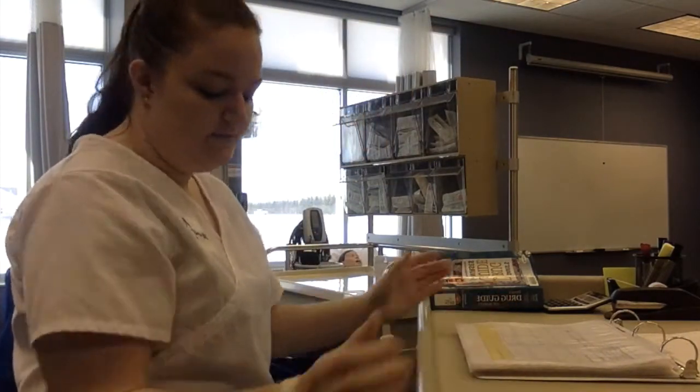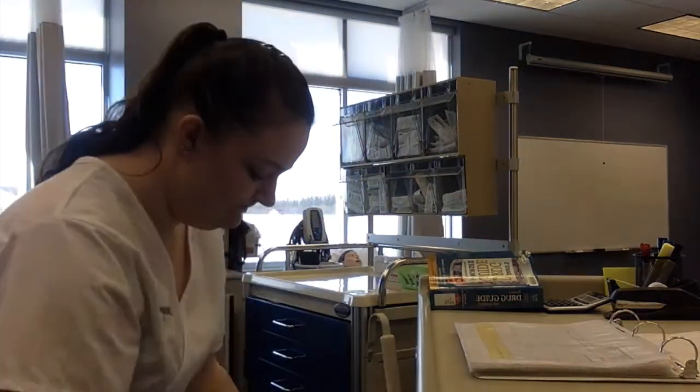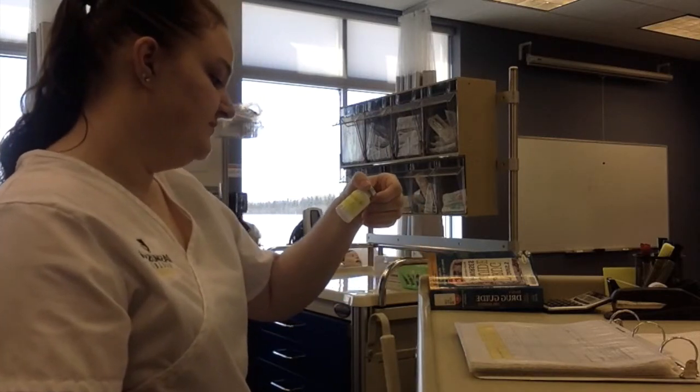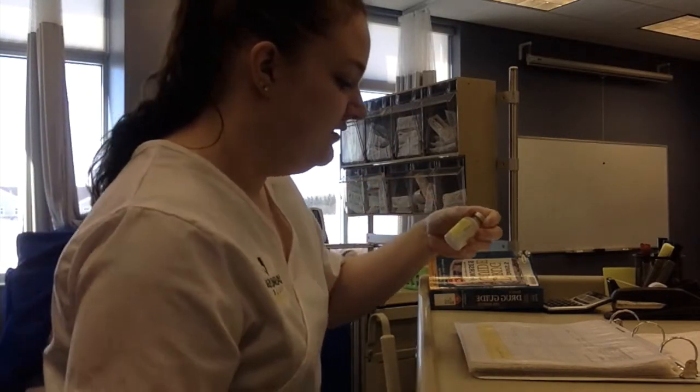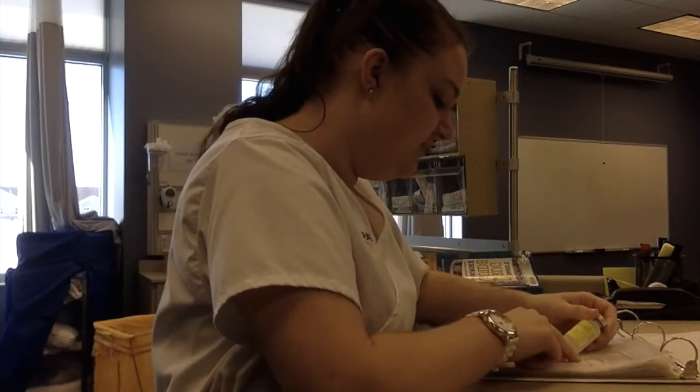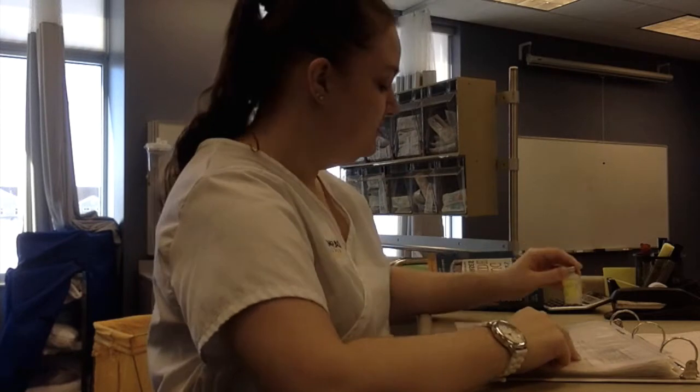So I would begin by gathering my supplies. First, my medication: naloxone, 0.2 milligrams per milliliter. First check done. I would check it against my MAR. After doing some calculation, I would know that I'm giving 2 milliliters.